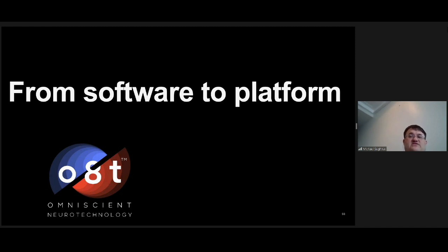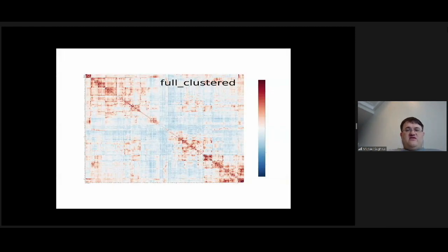And this kind of segues into, I think, the end of our course, where we're going to talk about what is the long-term vision. And again, we think we have a very good processing pipeline. There's a lot you can do with it. It brings a lot to bear, particularly in being extremely anatomically specific and leveraging a lot of the data that we've been able to put into one architecture to speed up the process of really being able to leverage prior knowledge. But again, we weren't here to create a new FSL.